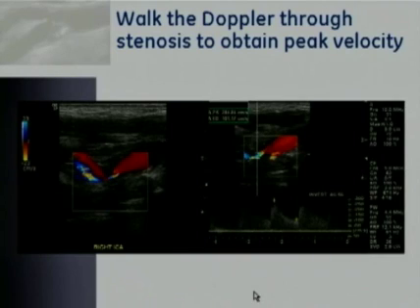This helps me a lot because if I'm looking at a residual lumen that has a diameter of only 1 millimeter and a breathing patient with cardiac pulsatility, and I have a 1 millimeter sample volume, I can't keep those locations matched in real time, and I'll just get pieces of the stenosis, and it will be very hard for me to get a good Doppler signal.